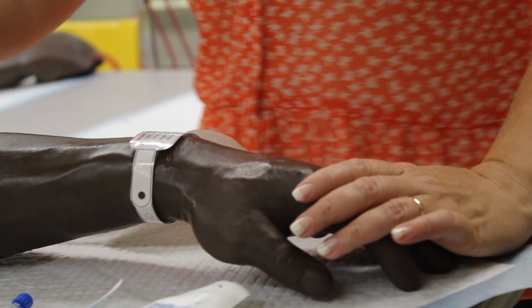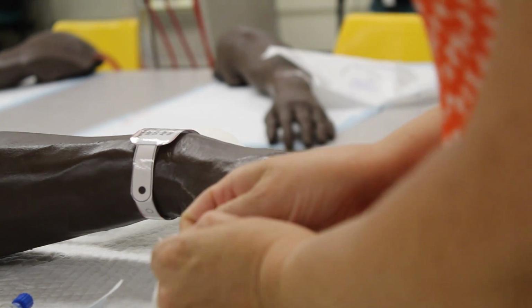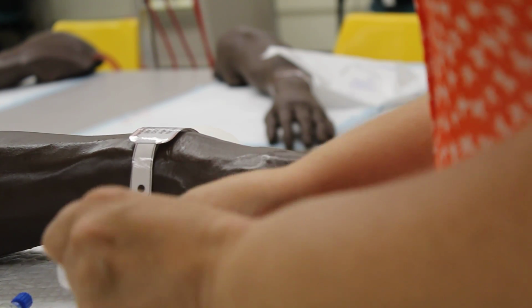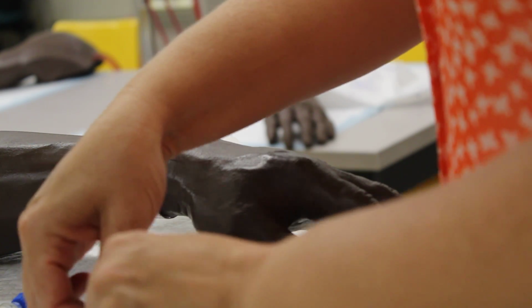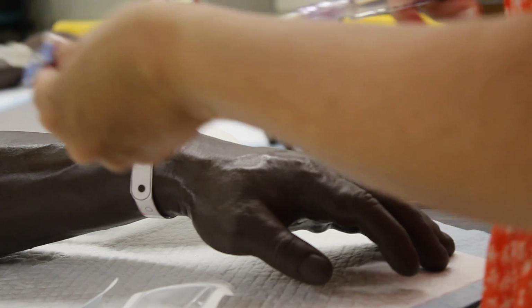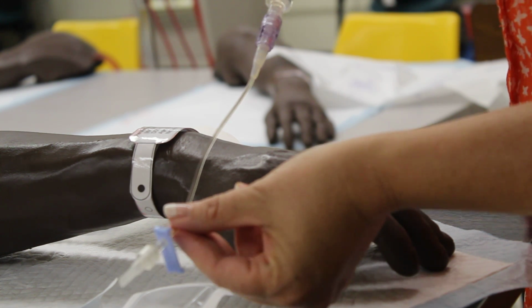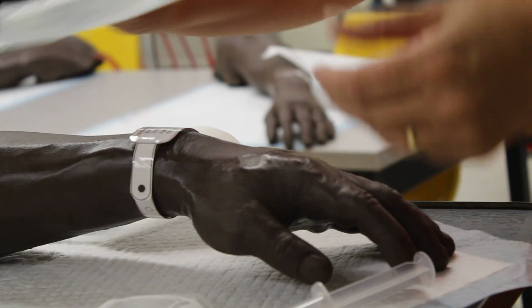After I find a vein, I then pop my tourniquet and I can get my equipment together and get that ready. So I'm going to open my extension set and flush that with normal saline. So I will open it, trying not to touch the tip of the extension set. If I do touch it, I can of course wipe that down with alcohol. So I can open my saline. Then I want to flush with just a small amount of saline. It doesn't take much. You can see it go through the tube. And then I can set this aside for in a minute when I get ready to use that.